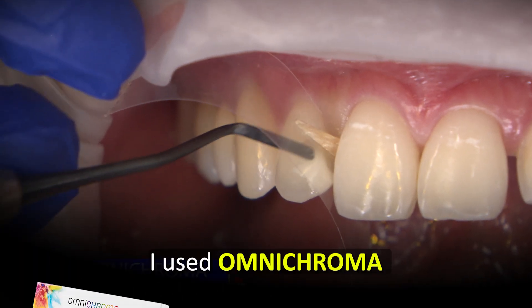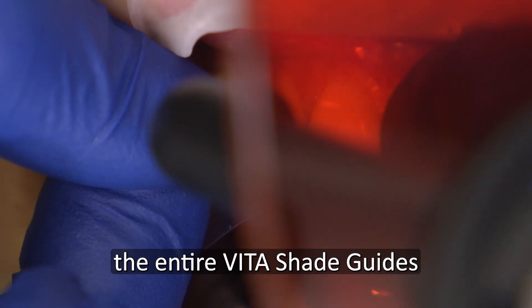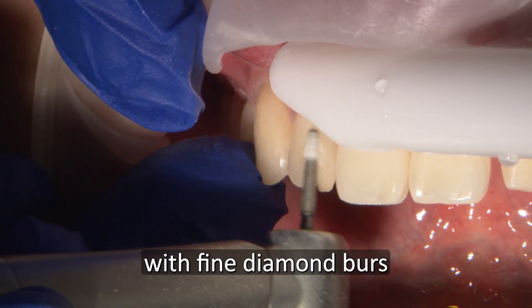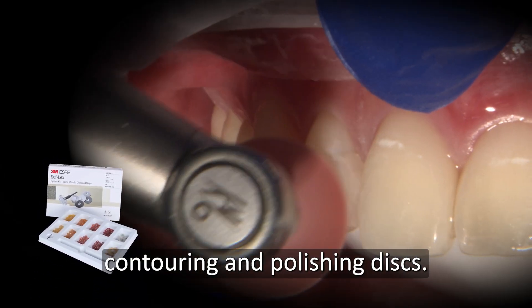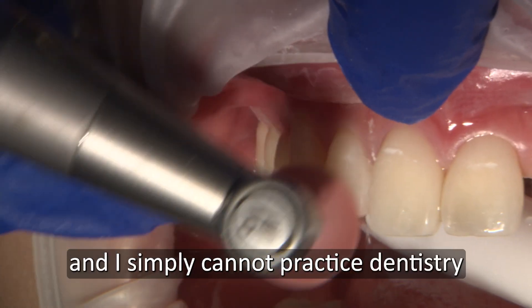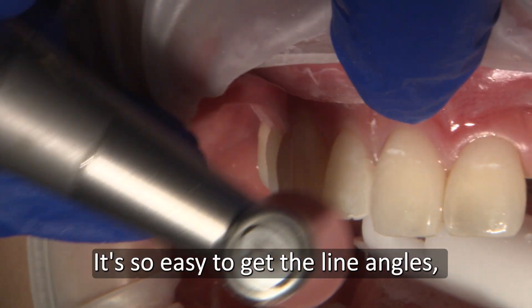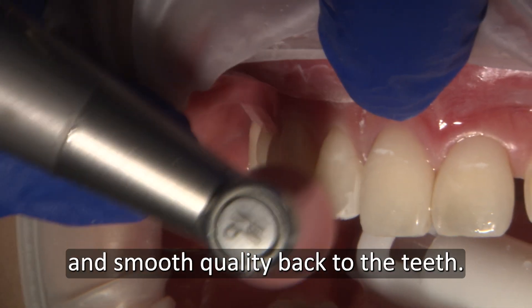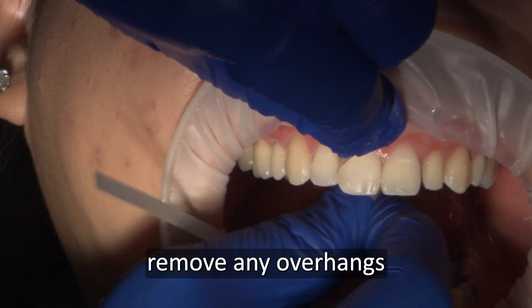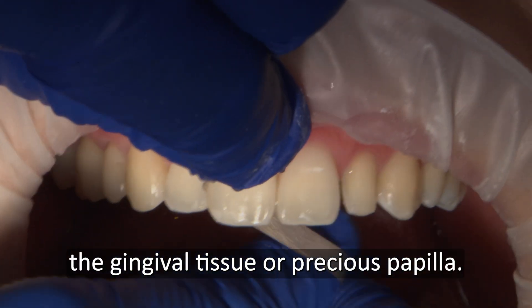I used Omni Chroma Direct Composite by Tokuyama, a resin-based restorative material that can aesthetically match the entire Vita shade range with just one shade. I finished and polished with fine diamond burrs and Soflex contouring and polishing discs. I've been using the Soflex system since the 90s and simply cannot practice dentistry without them — it's so easy to get the line angles, create symmetry, natural shape, and smooth quality back to the teeth. Soflex finishing strips are gently used to remove any overhangs in the interproximal area, being careful not to damage the gingival tissue or precious papilla.